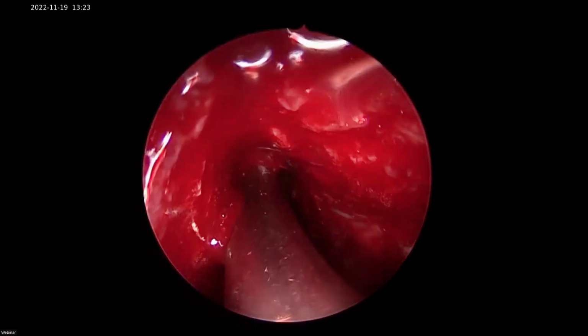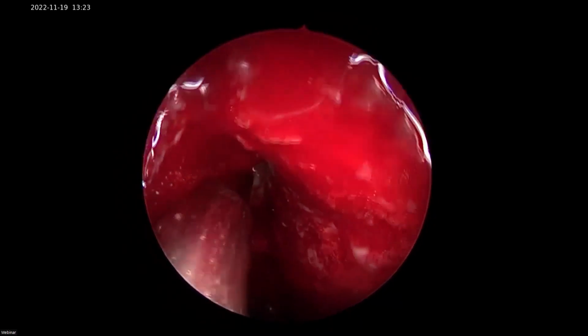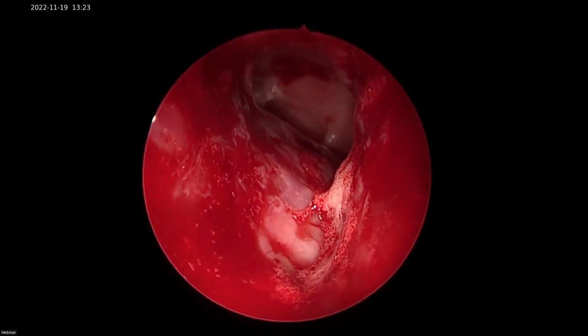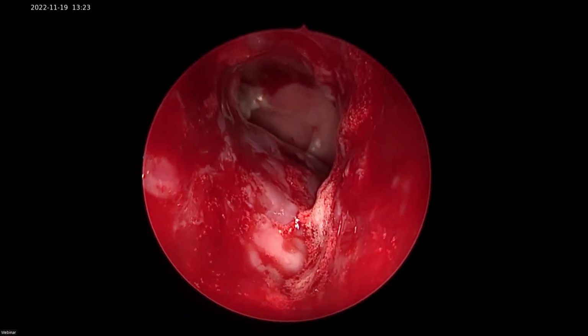I think you're touching it. Yeah, this is a 120 red blade. Section लगा उसका. Divider लगा दे. It seems to have loosened. It's loosened, I think. It's dropped.